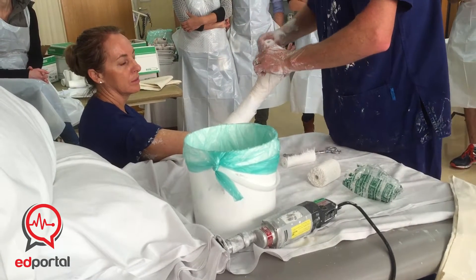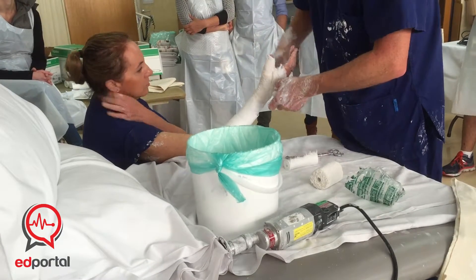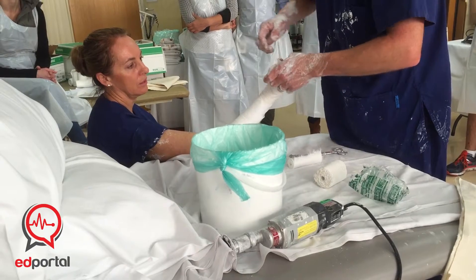Back through the web space. With each roll — you use two rolls of plaster, you go around twice with each roll — so it's a four-layer coverage.